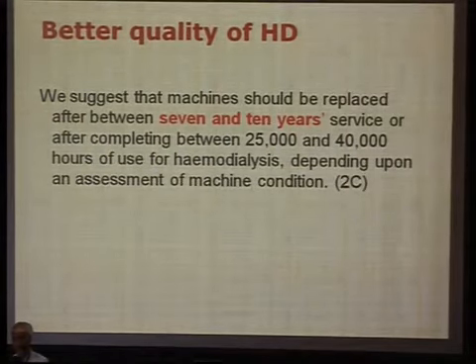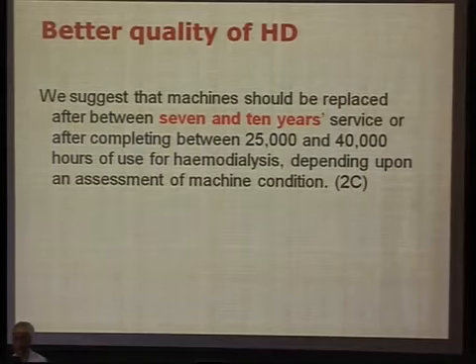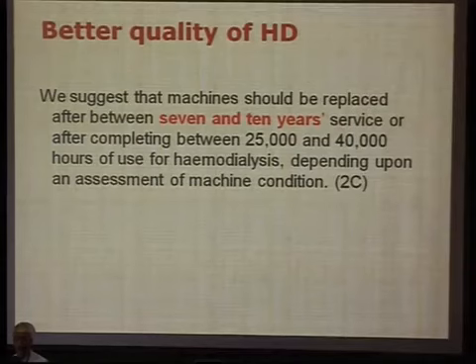Also, your machines should be replaced between 7 and 10 years, or between 25,000 and 40,000 hours of use in hemodialysis.